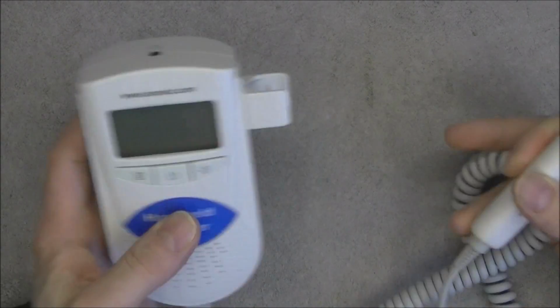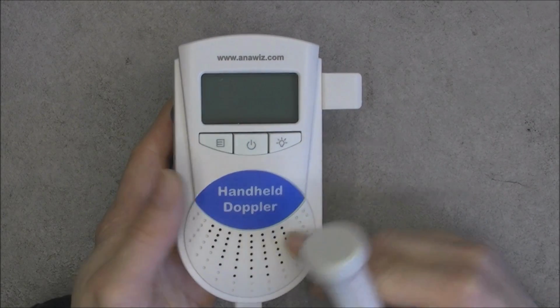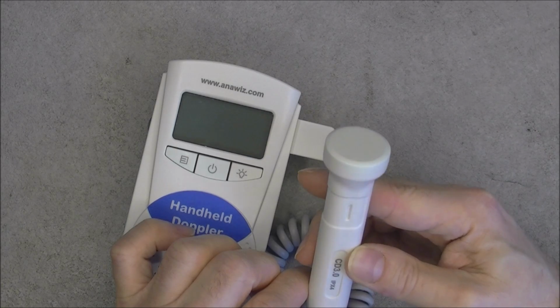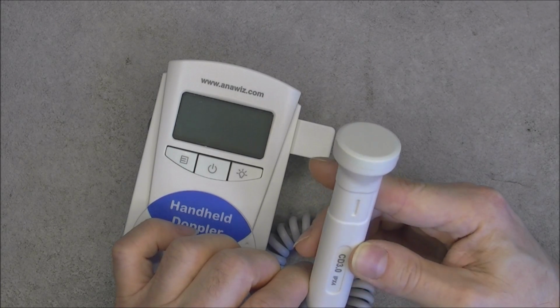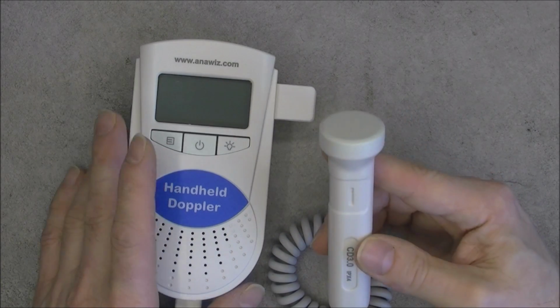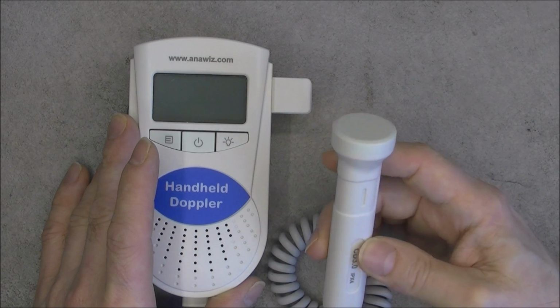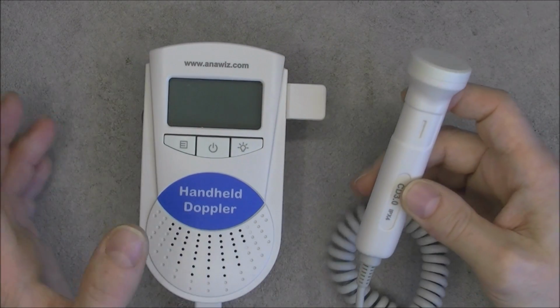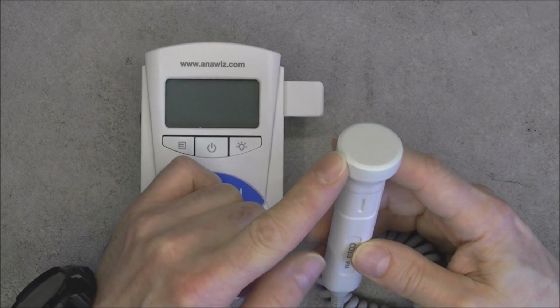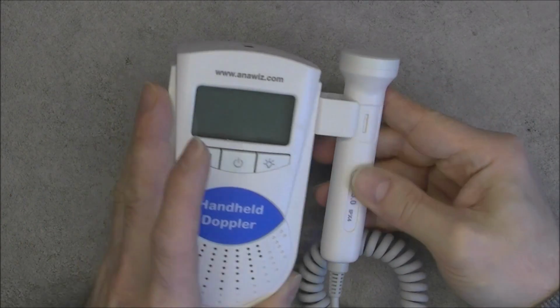As you can see, it is a little handheld box with LCD screen, loudspeaker and a probe. The probe is ultrasound, but there must also be a microphone to help with locating the probe properly at the nearest possible point of the fetus on the mother's belly. Apparently it senses the heart rate with ultrasounds, computes it and displays it.